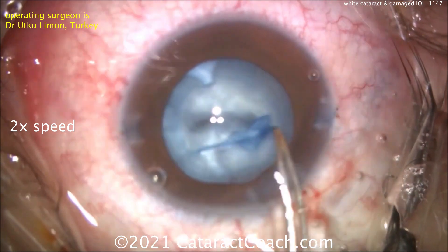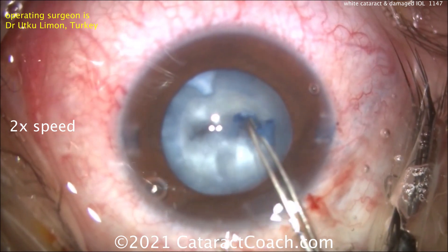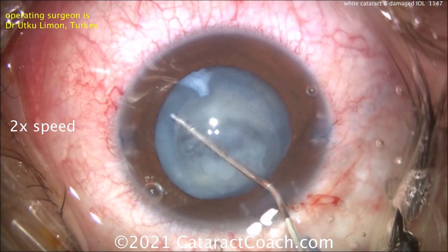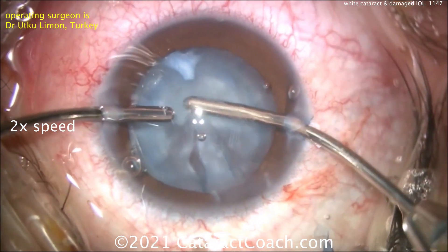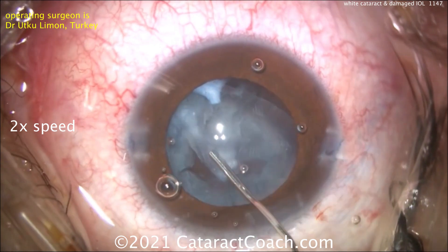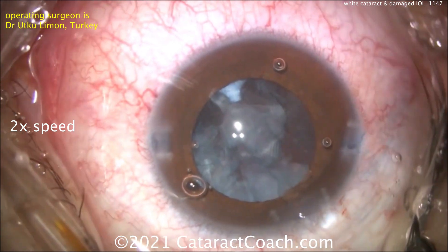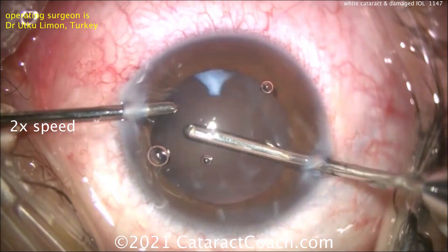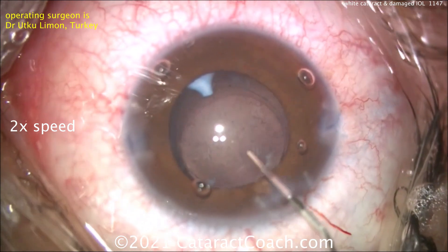Once that's achieved, you can finish the rhexis — there it is. Now the lens material is relatively soft, as this is a young patient, so it can just be aspirated out with the IA probe. I doubt there's really any nuclear density, so just going in with manual irrigation-aspiration and there you go — get all that lens material out with a little extra hydrodissection, washing everything out nicely. That looks fantastic.